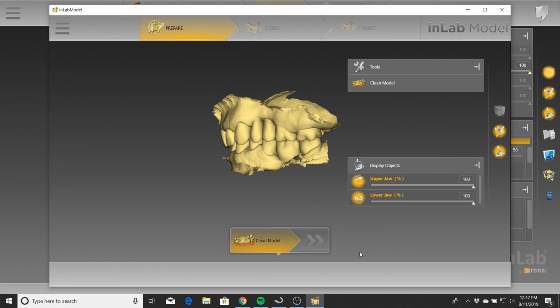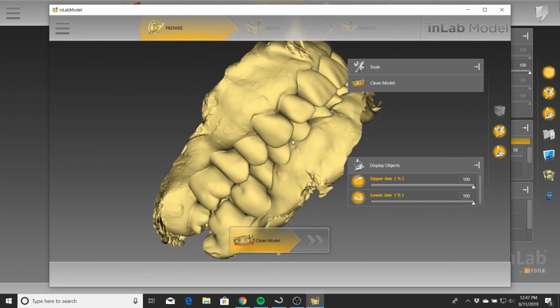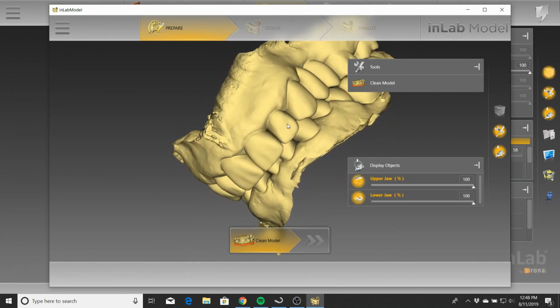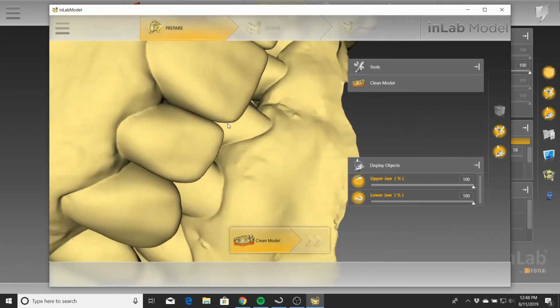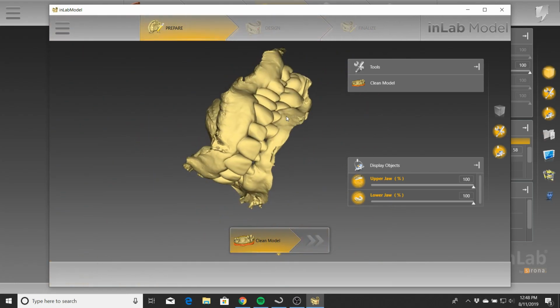It can be time-consuming. I think this one took me about, it's almost embarrassing to say, but it took about like 3 hours, and that's just because I put a tremendous amount of detail into the design and everything. Even the interproximal contacts. With a wax up, you can technically just leave these contacts red without adjusting them to green, but then you get little discrepancies in the model. So I make sure that all the proximal contacts are green so that you don't have any discrepancies.